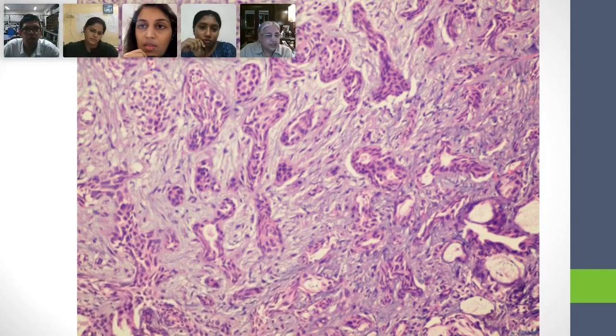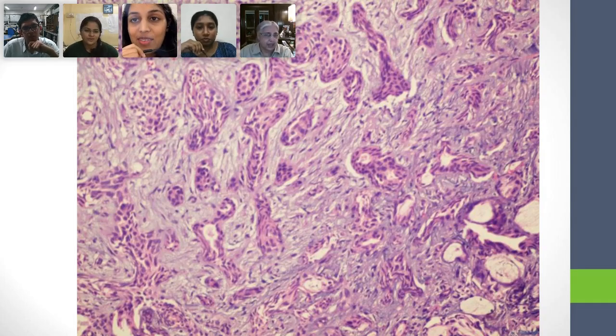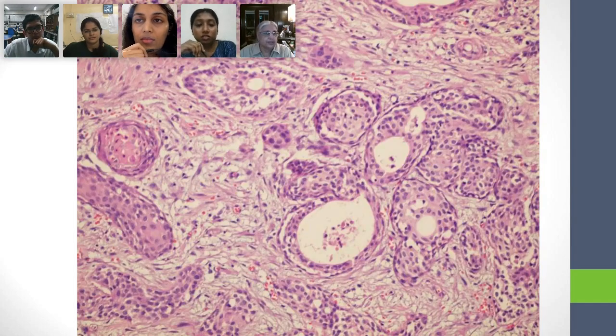You've never seen crush artifact in your life? This is an artifact in tissues, and it's either crush or it's a burn. That means a laser or something else has been used to cut this. So we have to discard it because we can't see anything of use in those areas. It's not dysplasia. It is not anything like that. This is an artifact from the previous surgery.